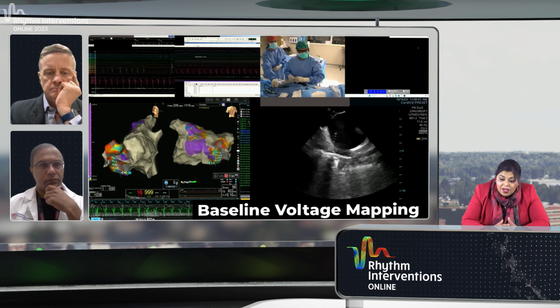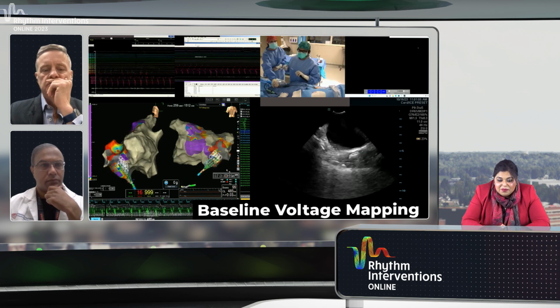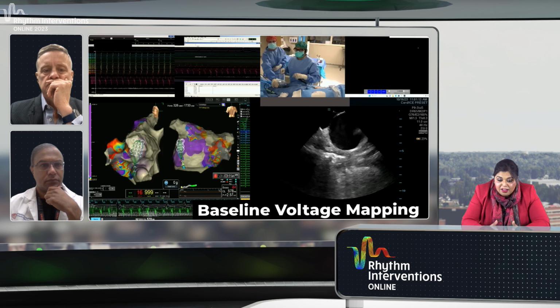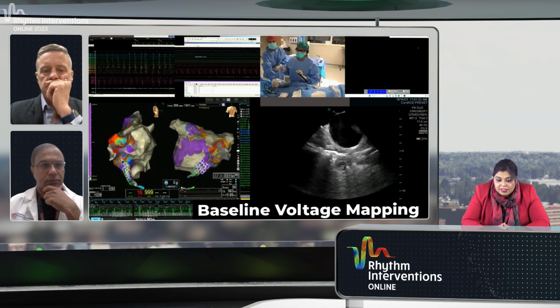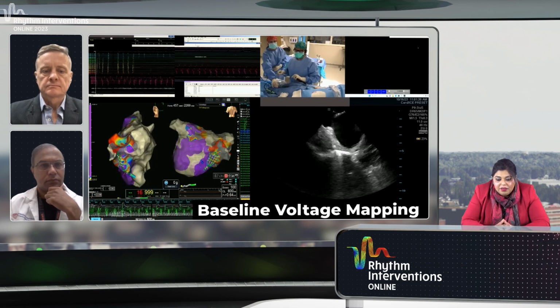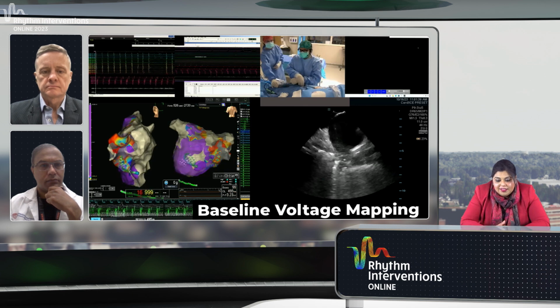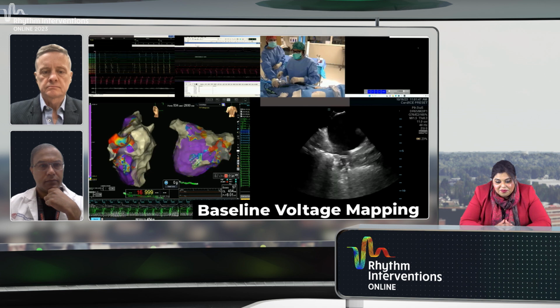But it's surprising, as we've seen in the earlier sessions, and we talked about how sometimes PV isolation is all the patient needs, and the patient actually did really well for a very long time, and obviously now is in a different state. And any thoughts on what our poll question was before, as you watch the mapping being performed here?